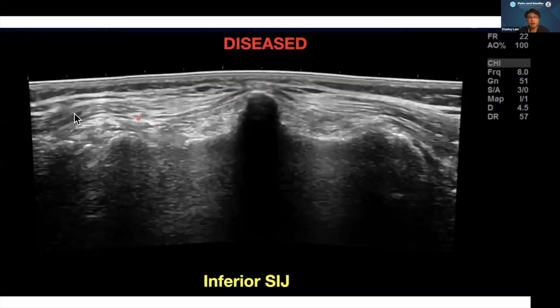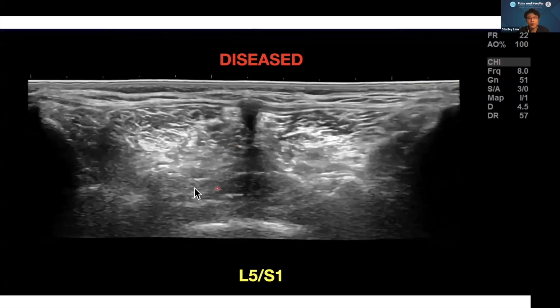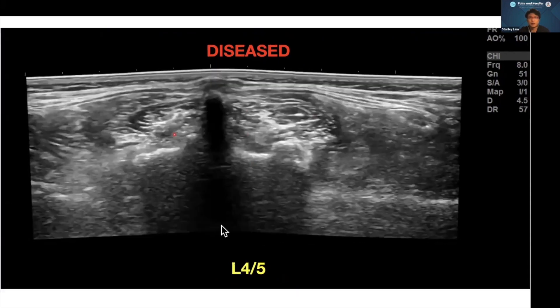Physical examination showed FRS dysfunction of the lumbar facet, right worse than left, and bilateral posterior nutation of the sacrum with slight right-on-left posterior sacral torsion. On ultrasound over the inferior SI joint, you can see the sacrum, the spinous process, the inferior SI joint, the ilium, going to the superior SI joint, and the multifidus muscle with the thoracolumbar fascia on top. Pay attention to this diseased pattern — this is going to the L5-S1 facet. You can see the osteoarthritic L5-S1 facet on the right side, and the multifidus is more hyperechoic on the right compared to the left.